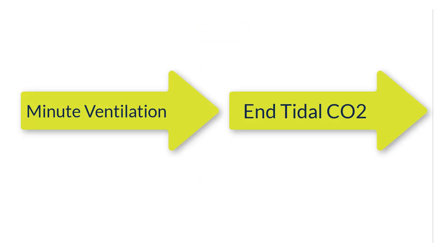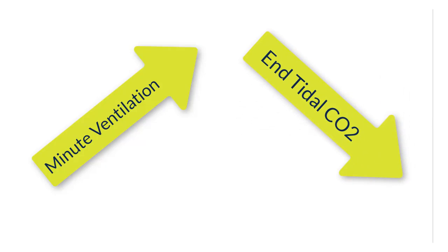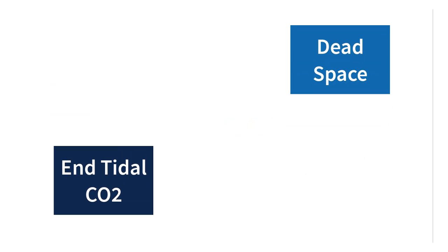If minute ventilation increases, there will probably still be a decrease in end-tidal CO2, but there could be either a decrease or increase in PaCO2, decrease caused by hyperventilation. End-tidal CO2 decreases to a degree that's proportionate to the extent of the dead space.